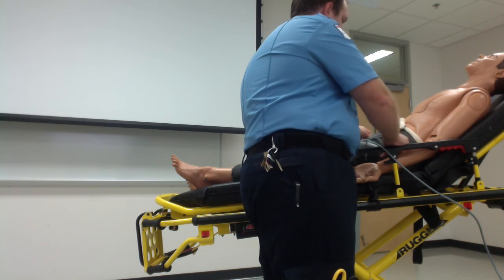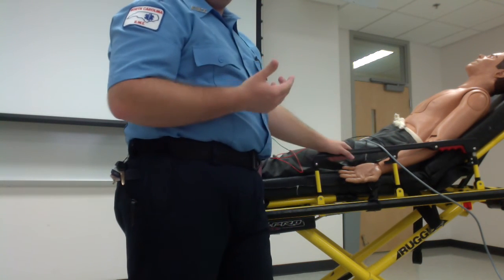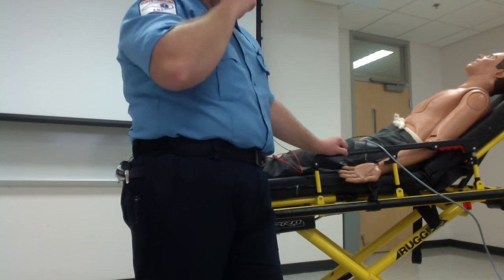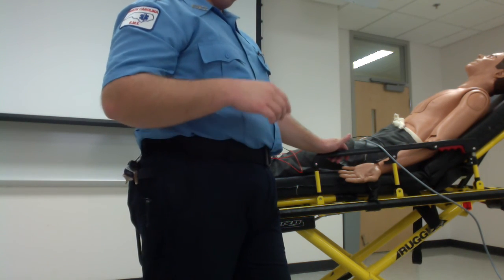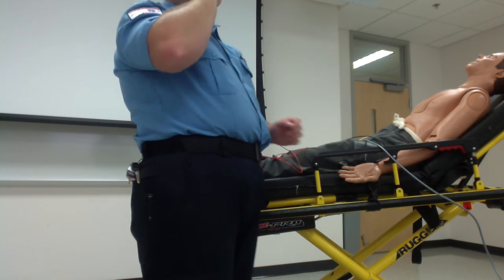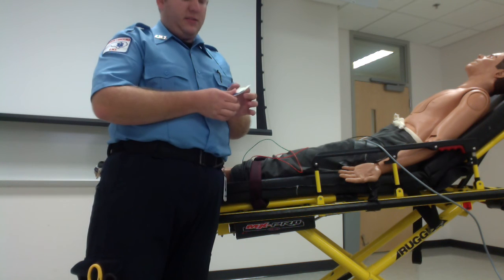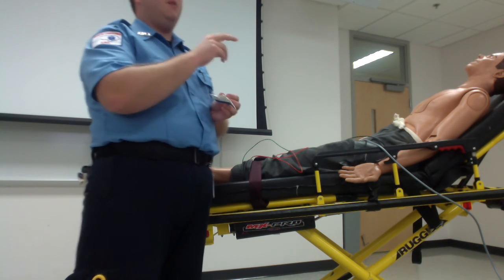After you've got that, this can be the point where your partner, whoever's working with you, gets the other 6 wires ready for your 12 lead, so you can just snap them on once you get going. A lot of places will leave the stickers attached to their wires. That can be great if you're running a 12 lead every couple hours. However, these stickers will dry out, and as they dry out, they won't be as effective.